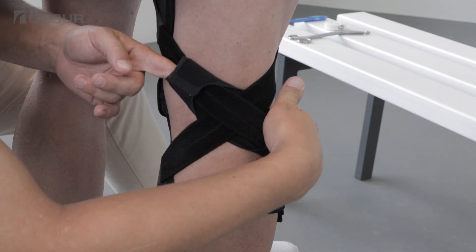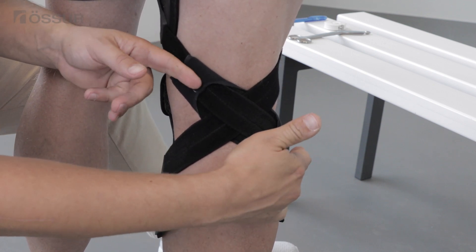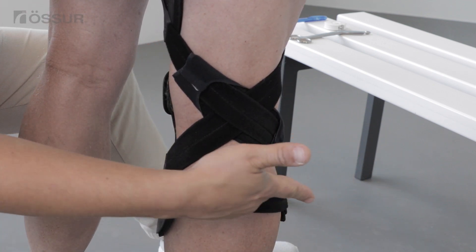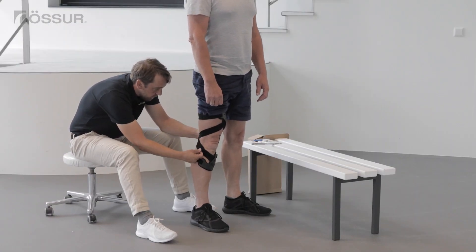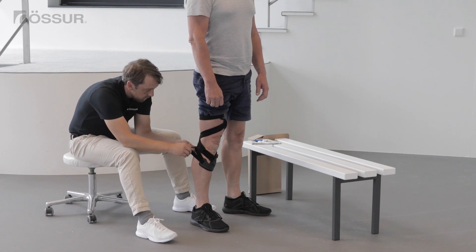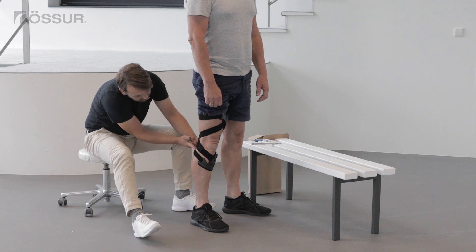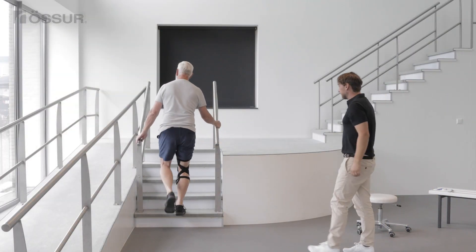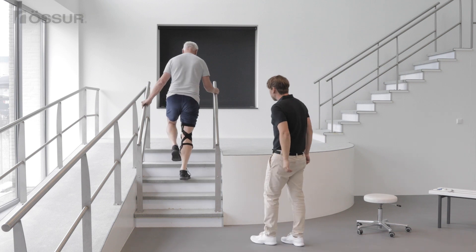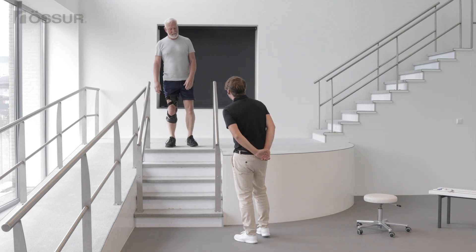Slide the popliteal pad to the correct position. Check tightness of the straps. Ask the user to take a few steps, and also on stairs or a slope if possible, to see how the brace fit feels.